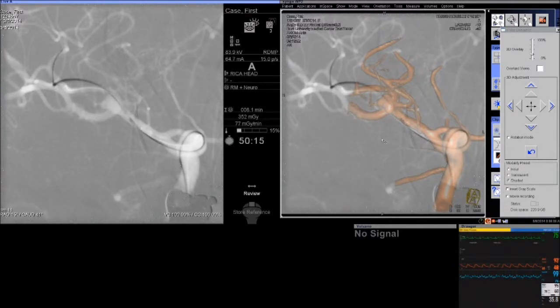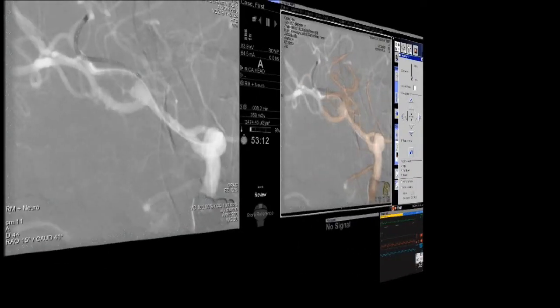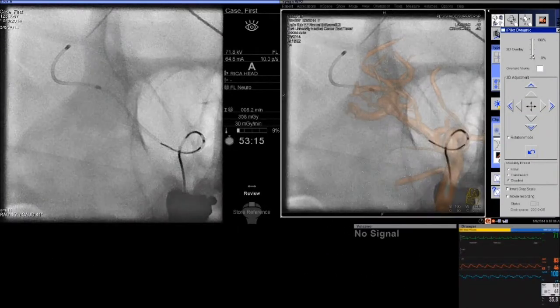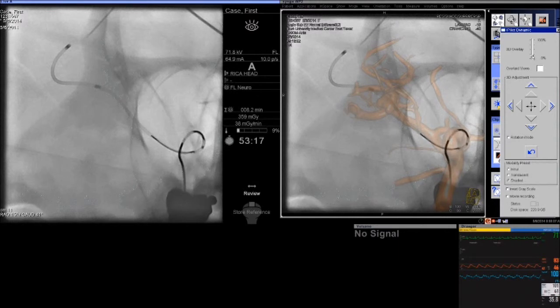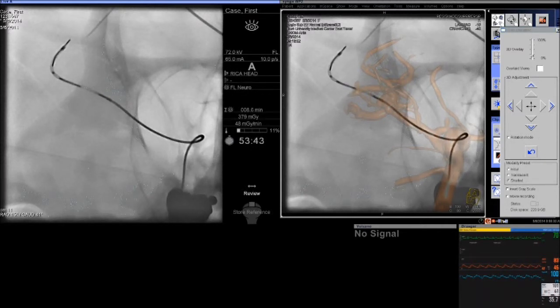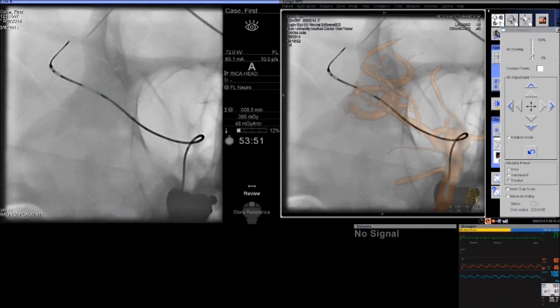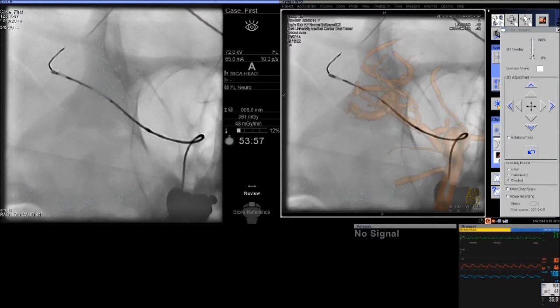This distal position is very crucial — having a distal placement of the microcatheter means that when you navigate your stent into this location, you will not risk losing your catheter position. In this case, we chose the shortest Enterprise stent available. One could use an Enterprise without a distal tip, but here we have one with a distal tip. The more distal you go into the anatomy, delivery systems with no distal wire will be more beneficial. In this case, we felt comfortable we had enough landing area for a wire.